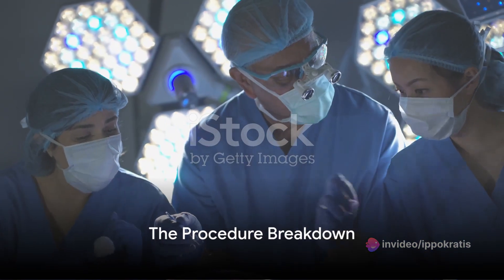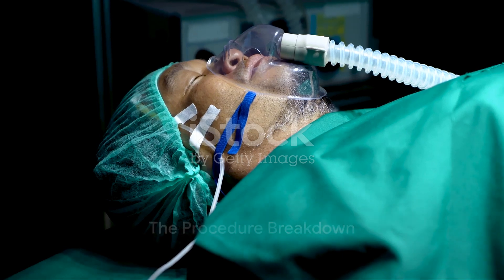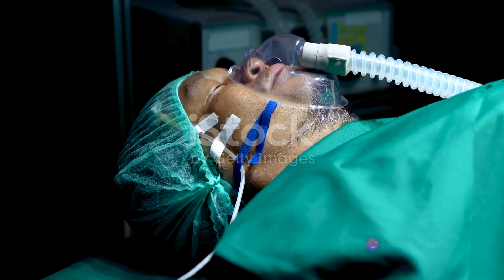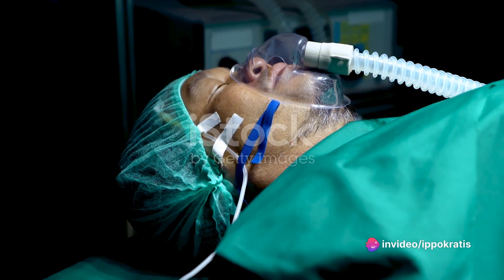Let's break down the procedure into four key steps. First, the preparation. The patient is usually positioned face-down, and local anesthesia or mild sedation is administered depending on the case.